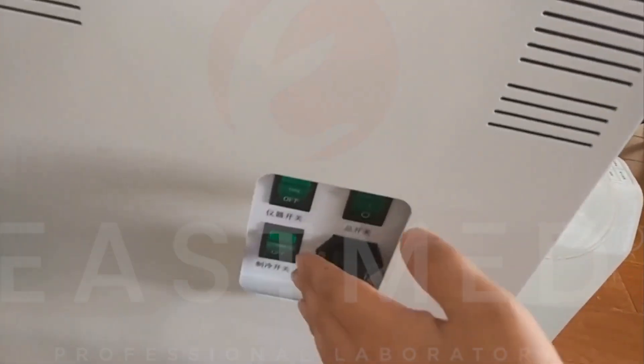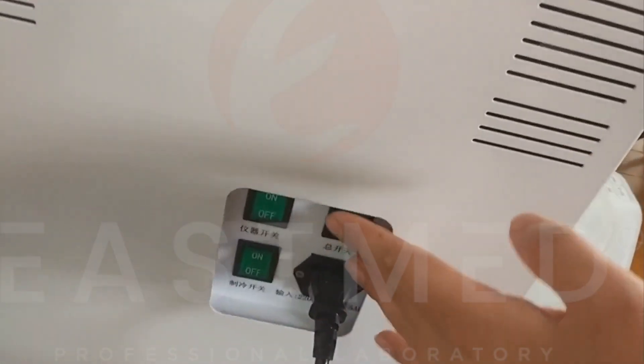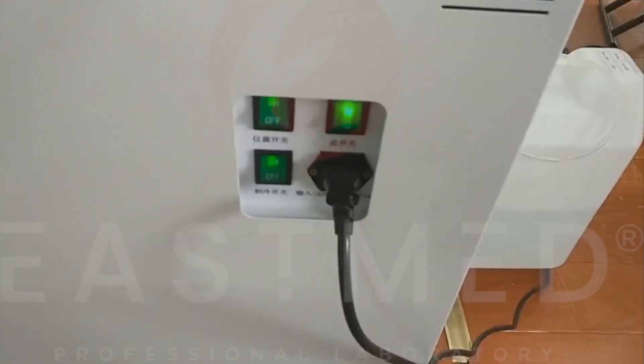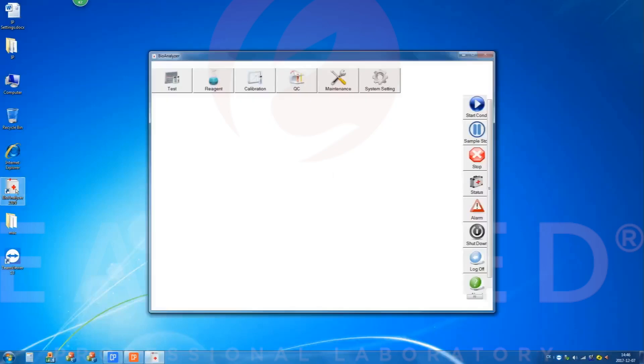Open all the power switches on the side of the instrument. Double-click the desktop Bioanalyzer 2 icon to start the software.